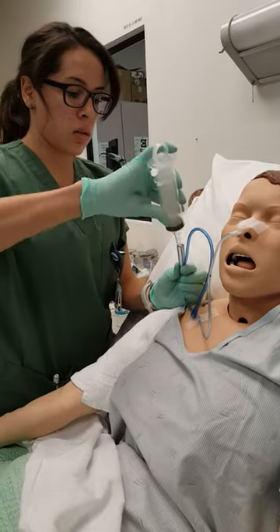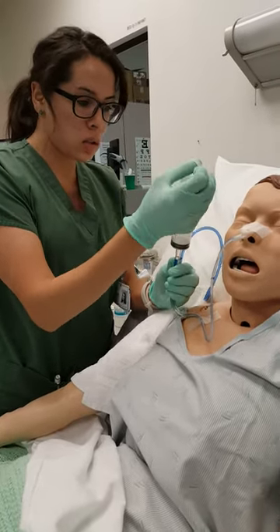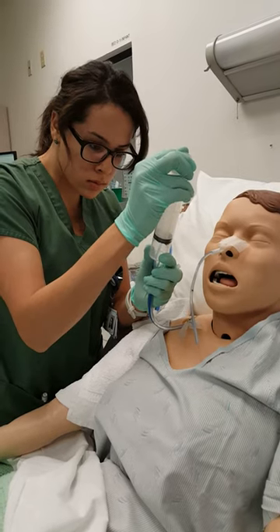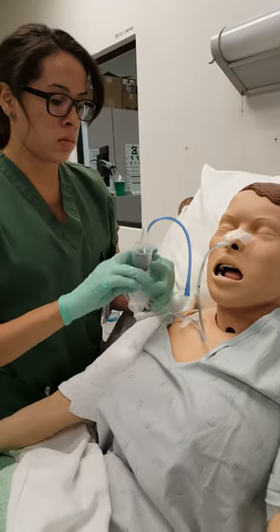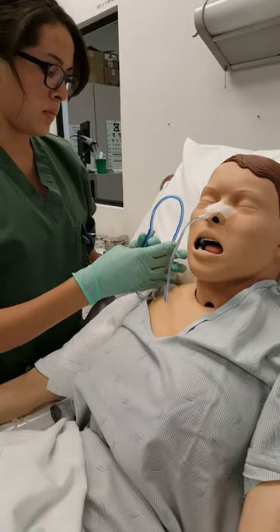I'm just gonna take about 20 to 30 cc's of the gastric juice out, okay? Okay. So how's your day going today? It's pretty good.